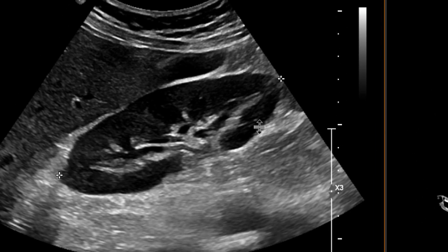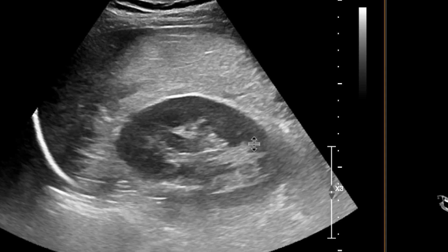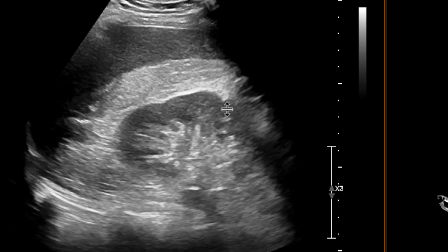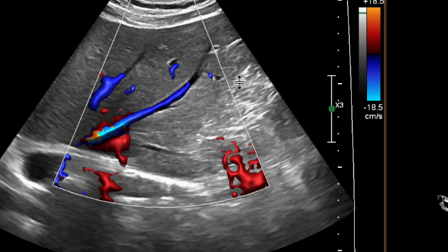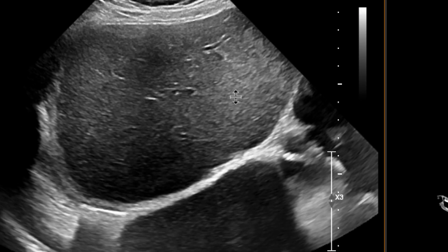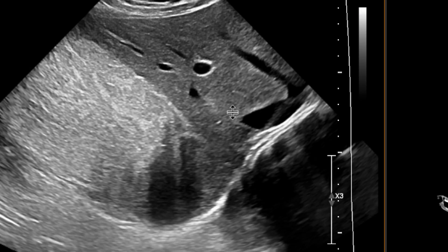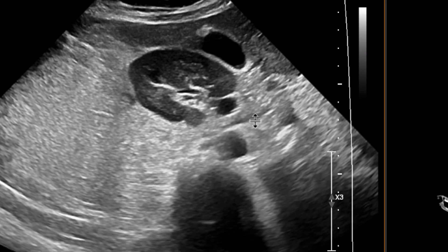What I really wanted to point out is an abnormality associated with the right kidney. The right kidney itself looks okay, but surrounding the right kidney you can start to see there's an abundance of echogenic soft tissues surrounding it that really does look like fat that's hypertrophied in that location. And the more we look at it, we can start to see there's a lot of fat surrounding the right upper quadrant, and in particular, surrounding that right kidney.